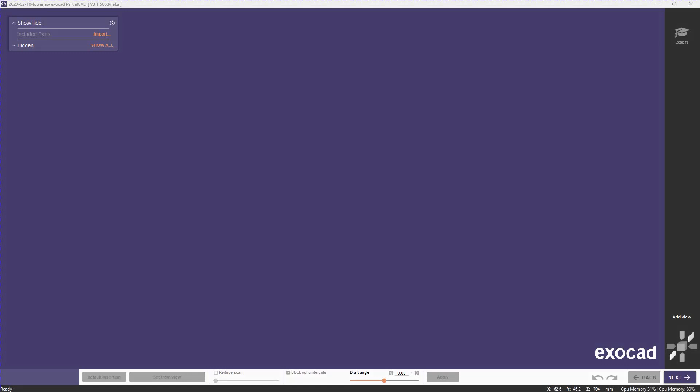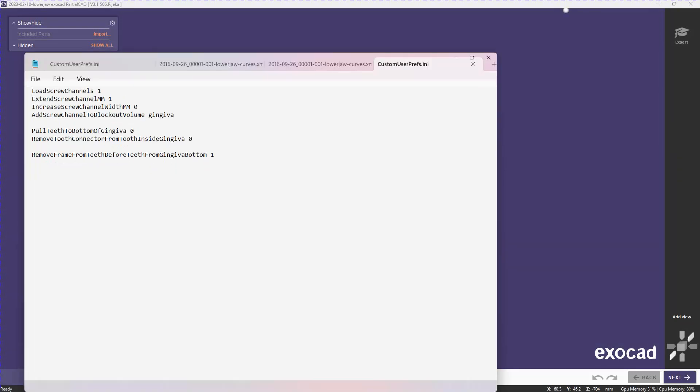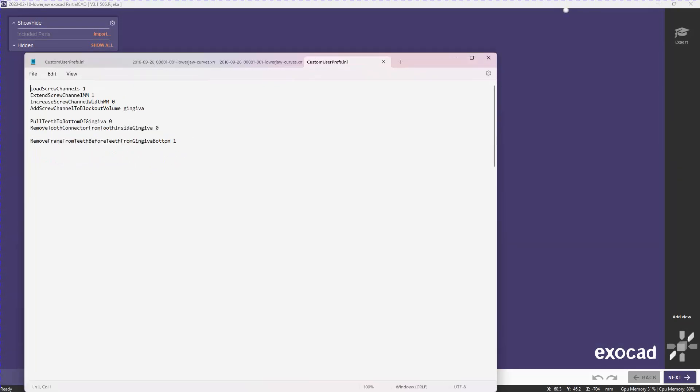First we're going to take a look at the settings. The most important one here is the loading of the screw channels. The three below that just specify where the screw channel is going and certain offsets that you might want to apply to them. But the main thing you have to do is the first one.